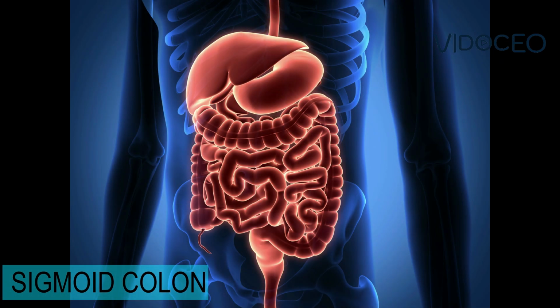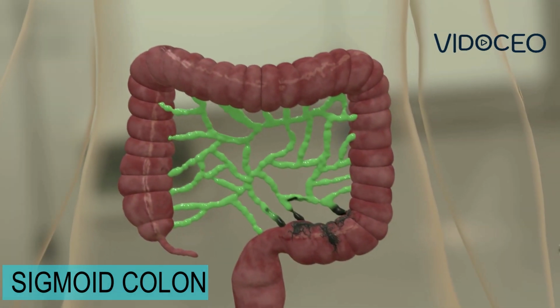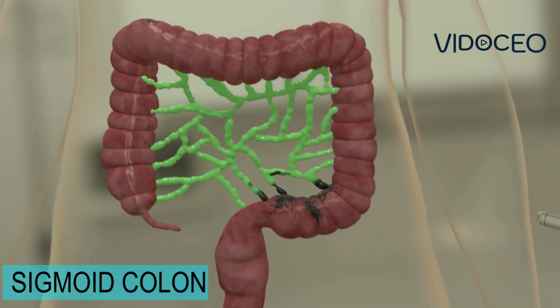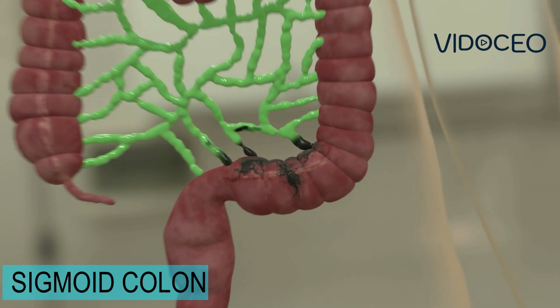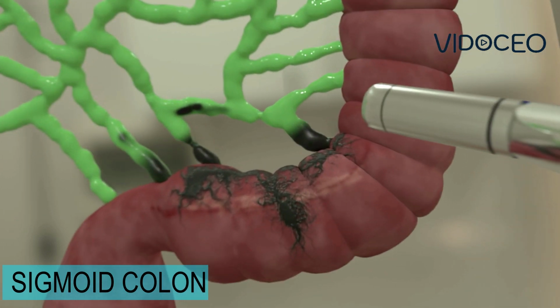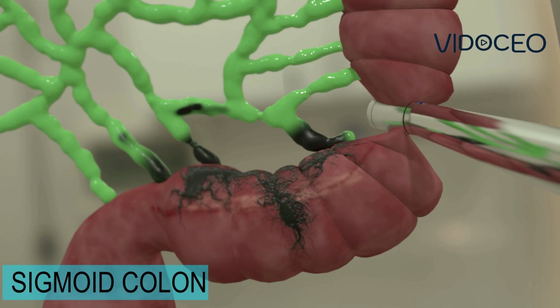The sigmoid colon is the portion of the colon in the left lower abdomen. It is the last part of the colon before the rectum. If there is cancer in this portion of the colon, it is important to remove the lymph nodes that are attached to the portion of sigmoid colon. The sigmoid colon is identified and freed from any surrounding attachments. The colon above the cancer is divided with a stapler device.